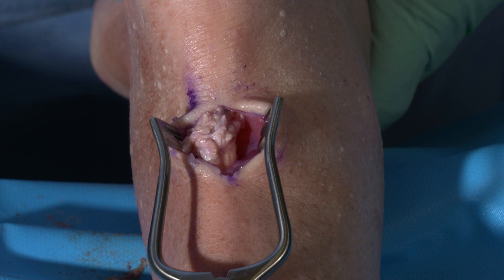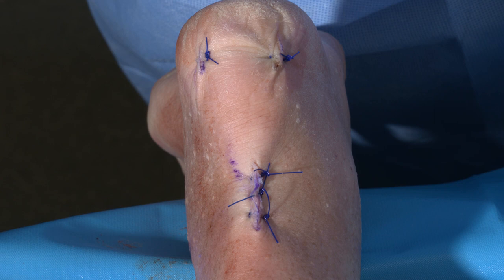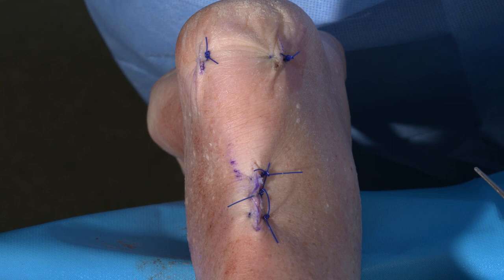After the repair, the wound is closed in layers. I will re-approximate the peritenon and use some simple interrupted sutures. Clearly, a very small surgical footprint, which should allow for more rapid healing and faster rehabilitation.